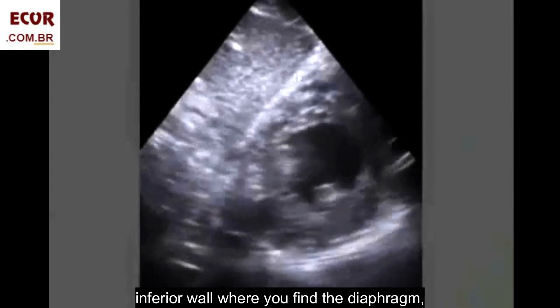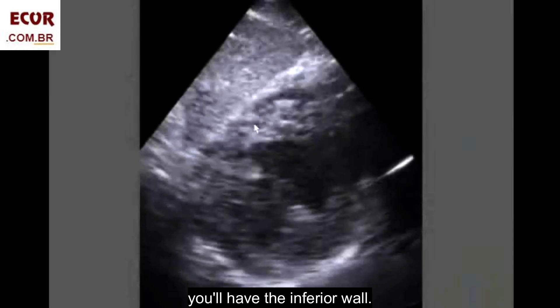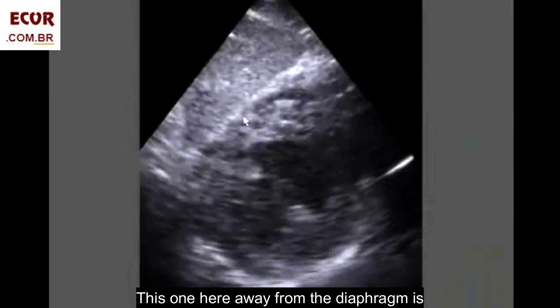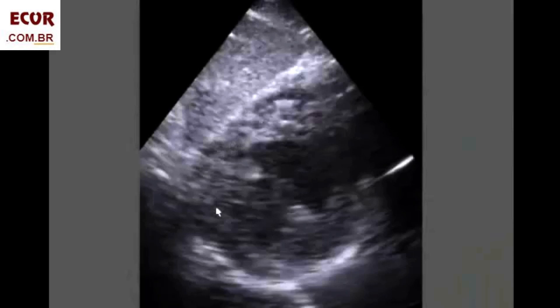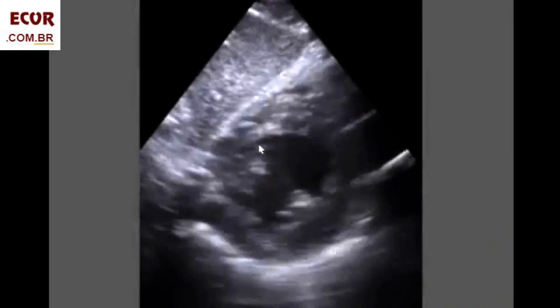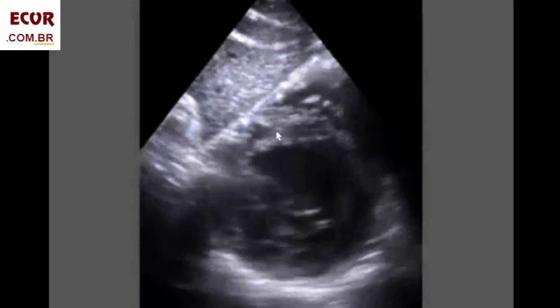Where you find the diaphragm, it's here — you have the inferior wall. This one here, away from the diaphragm, is the posterior lateral. The inferior wall is quite hypokinetic.